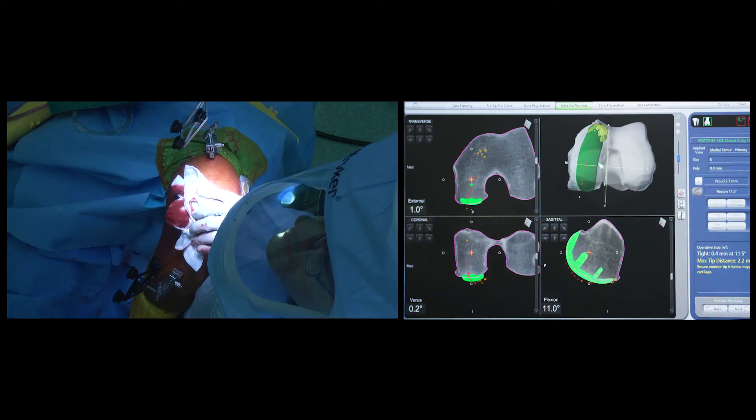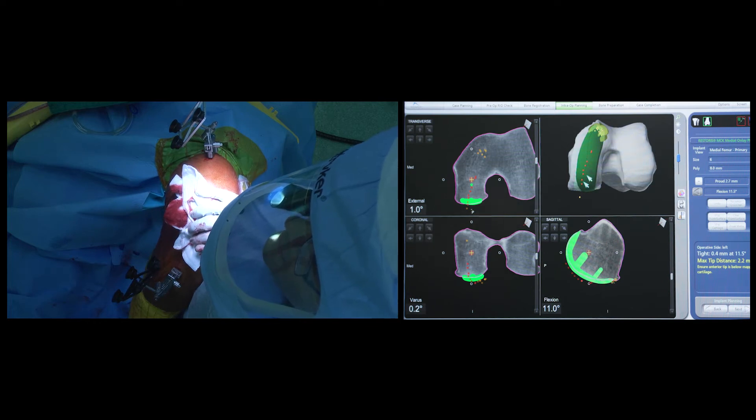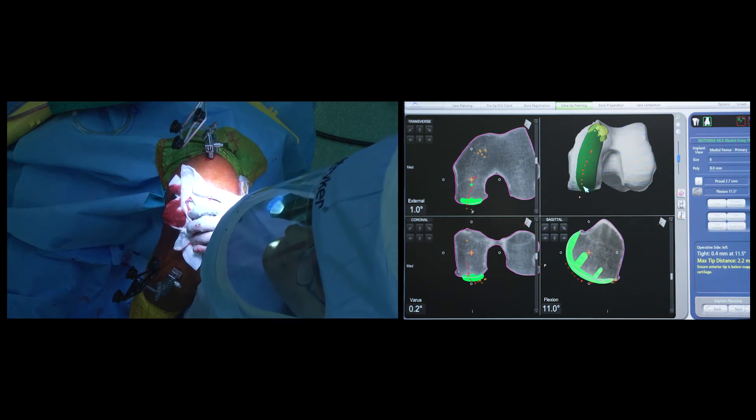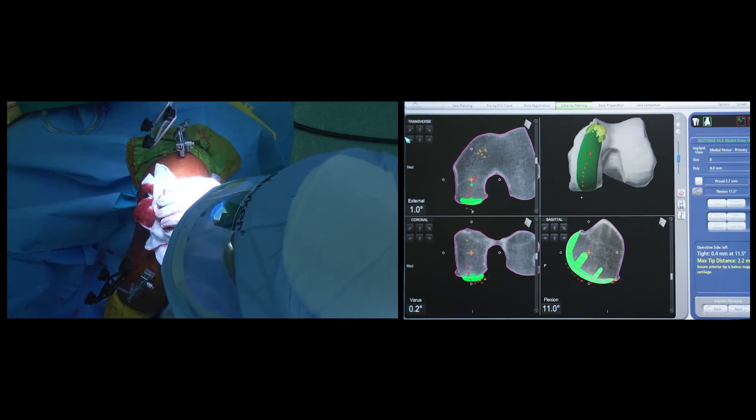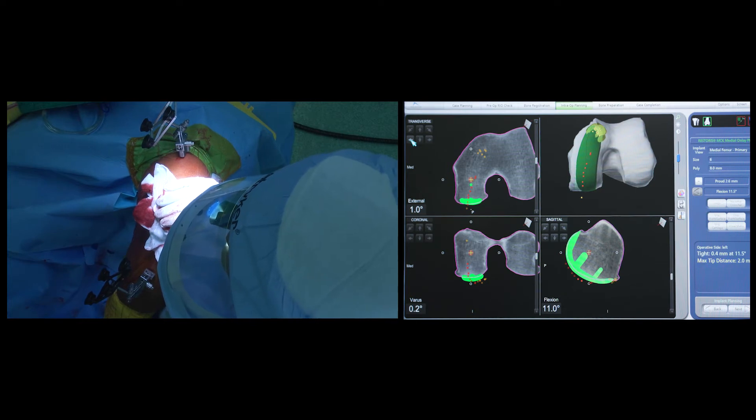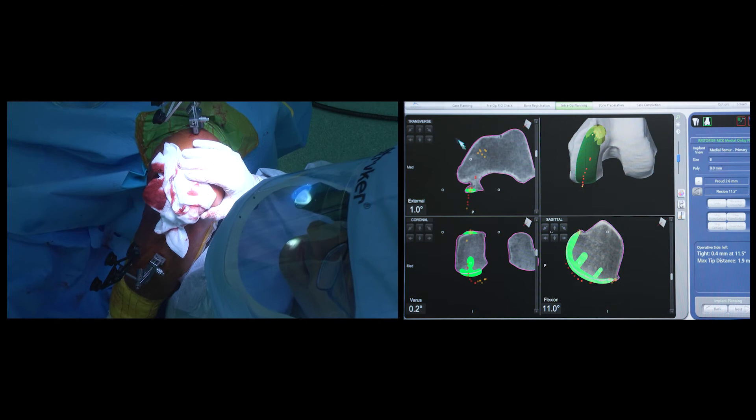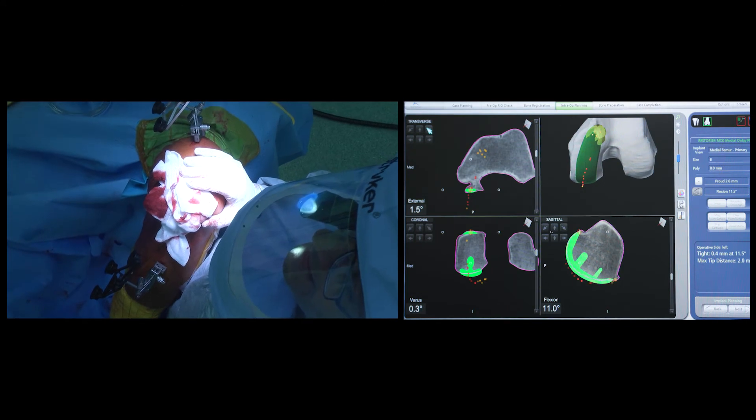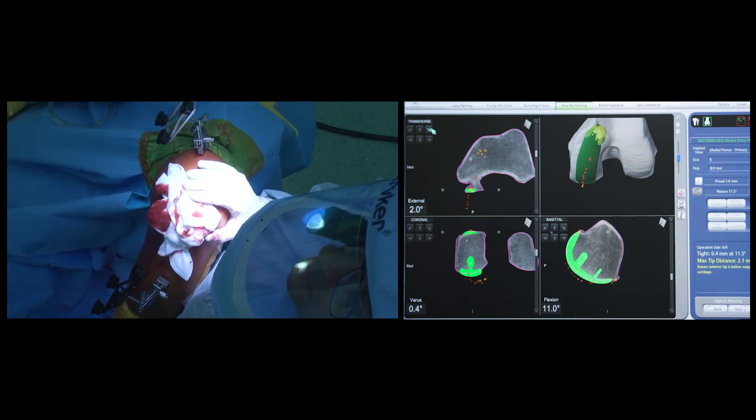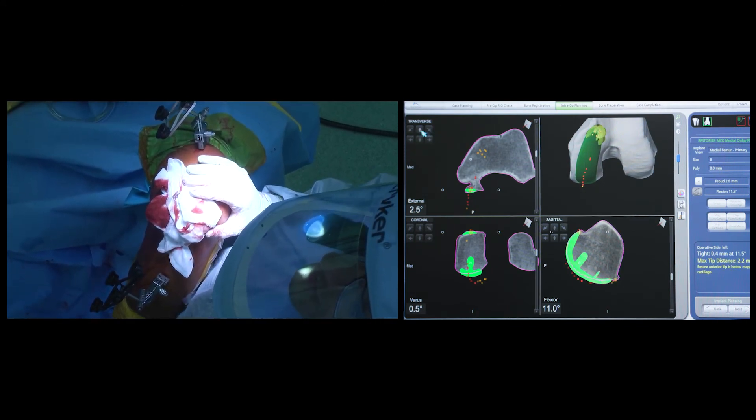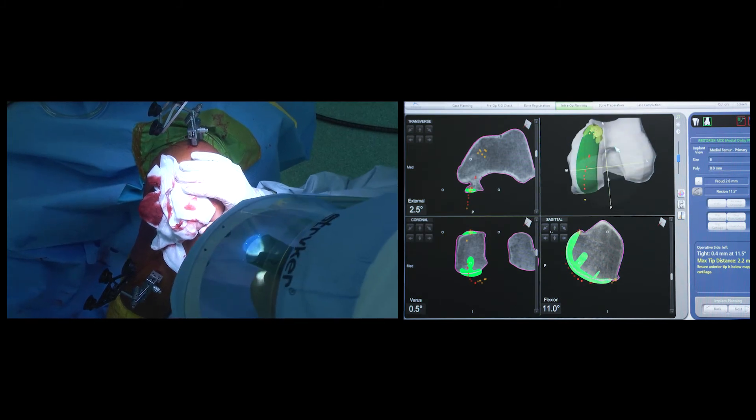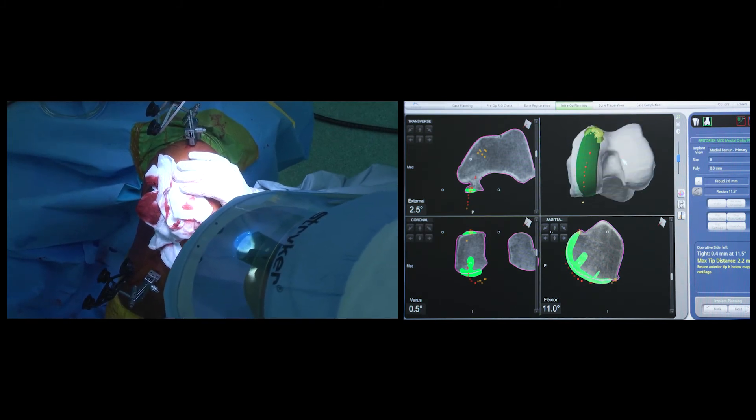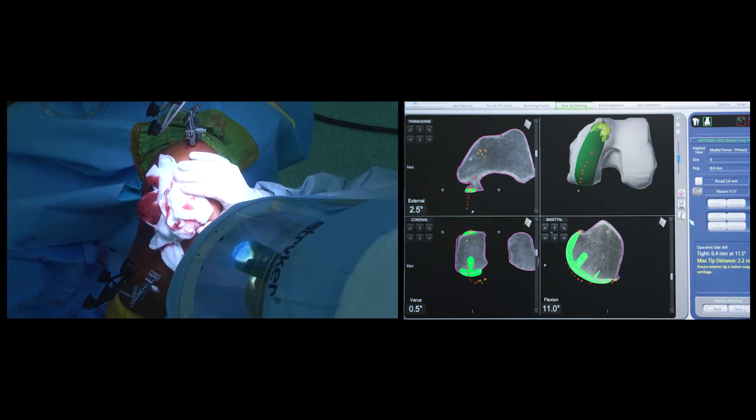Here, as can be seen, in flexion the red dots are slightly too medial and in extension the red dots are slightly too lateral, and hence I move my femoral component more medially and slightly externally rotated to achieve a more ideal tracking in this scenario.